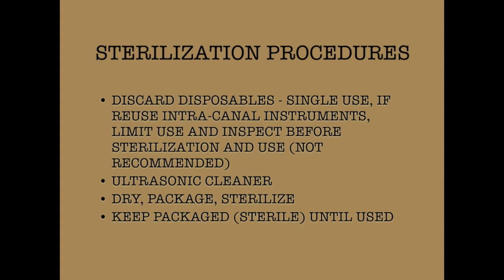Now let's look at the sterilization procedures. All infection control and sterilization procedures really should be standard in a dental office. I'm a real stickler about this. There are certain instruments, though, that must be handled in particular ways. I want to talk in particular about the intracanal instruments, which are actually single-use instruments. They are meant to be disposable. That doesn't always happen in dental offices, even in endodontic practices.